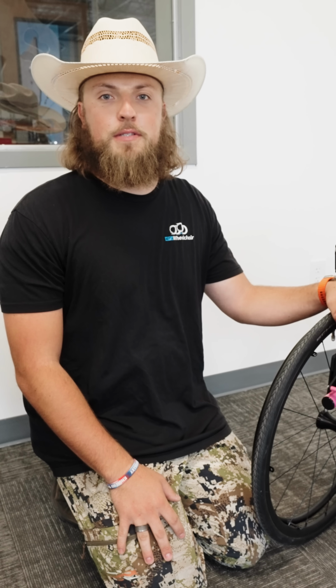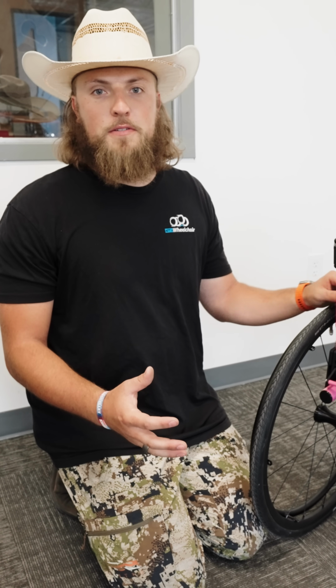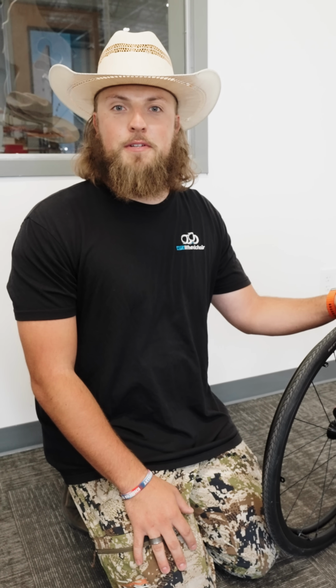All right, so now we're going to be talking about measurements that can be adjusted. And keep in mind with all of these, we'll be talking about these in the how-to videos. But these measurements, a lot of them rely on each other. So if you change a measurement, it may affect another one. So that just needs to be taken into account while you're adjusting these measurements on your chair.